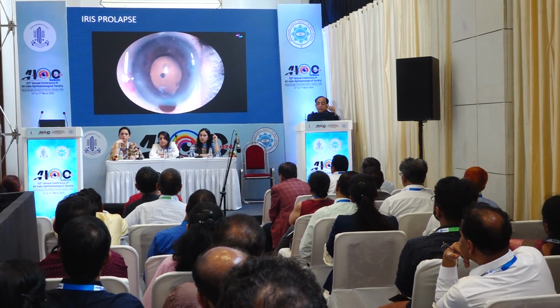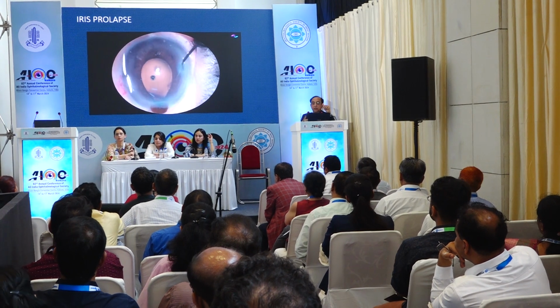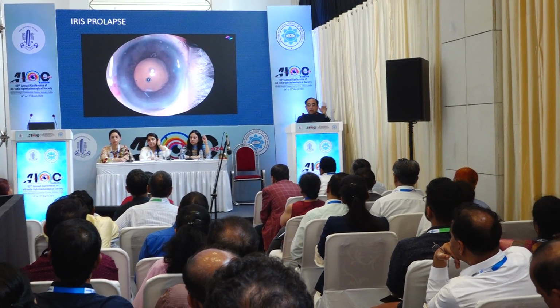And the mistake here is that the viscoelastic is being injected too much, so it will try to leak out. You should not inject the viscoelastic too much if the iris is prolapsing. You should go from the side port and pull the iris in.